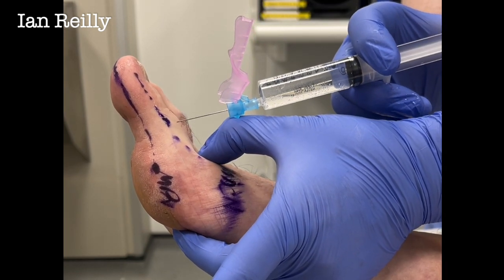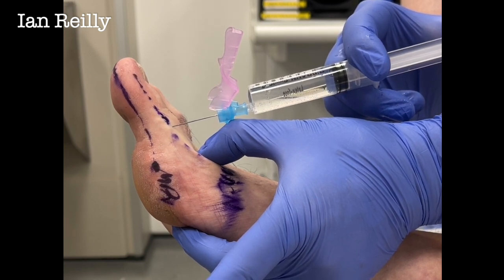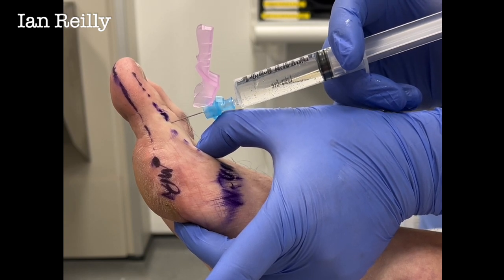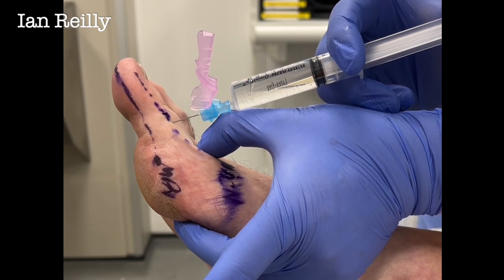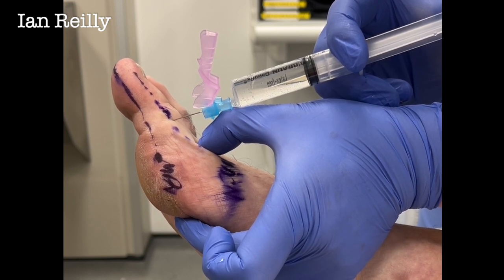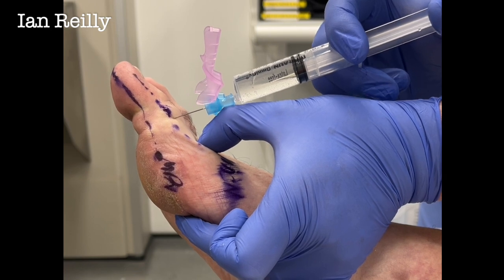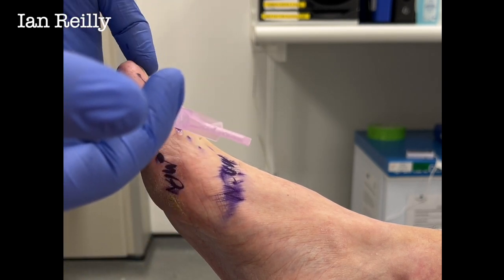Right, a wee scratch — three, two, one. The first thing is to put a little bleb at the top for the dorsal nerve, and then you go all the way down. You might get a wee sting there. You want to see that plantar skin tent and blanch — that's what you're looking to do. That's really where you want to concentrate your local anaesthetic. Some practitioners inject on the way down and on the way out, but I inject on the way out. I'll often come across and do the dorsal aspect of the toe as well.